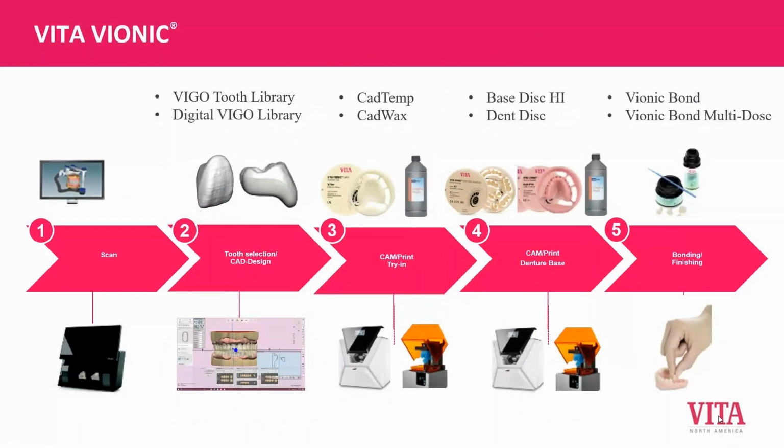So, this is a basic overview of our VITA Vionic workflow. Whether or not you're familiar with our product, if you look on our website or any of our materials, you'll see the Vionic name, and there are several other names that go along with our digital offerings. I just wanted to explain it so that everybody understands.